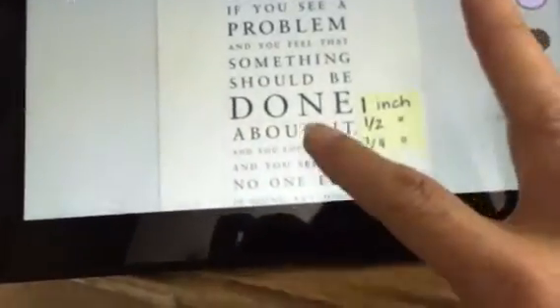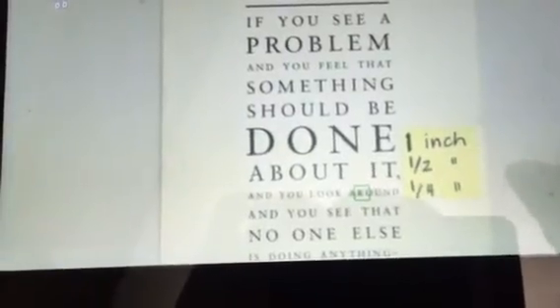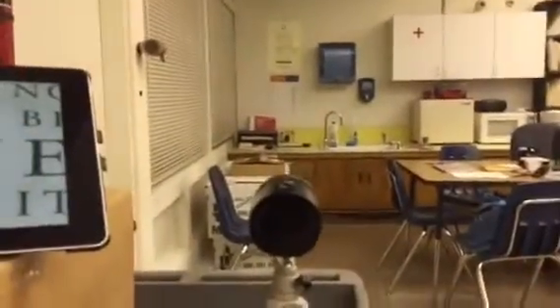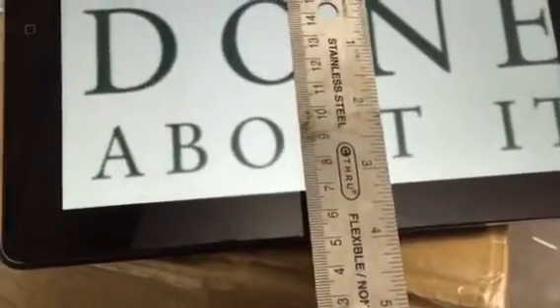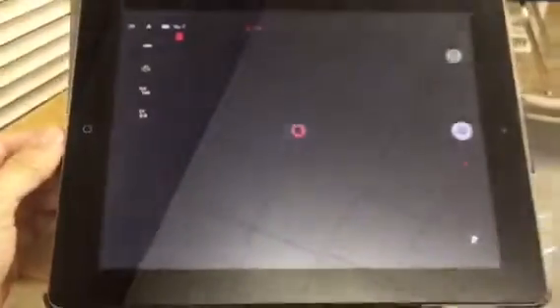It's certainly legible. And if I snap a picture and go to the button on the iPad that allows me to view the picture I just took, I could certainly zoom in more. That one-inch letter that's 15 feet across the room is now on my iPad at almost an inch and a half. So I would zoom back out and hit the button to go back to what would be a live viewing mode.